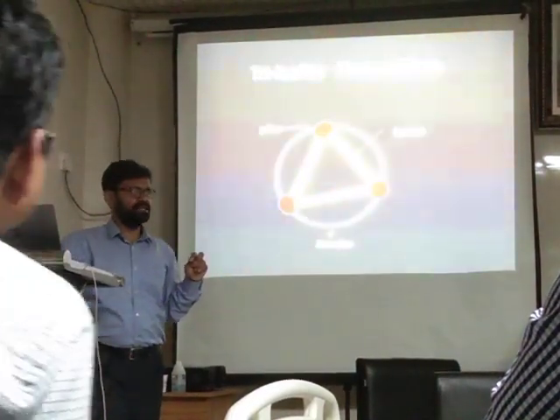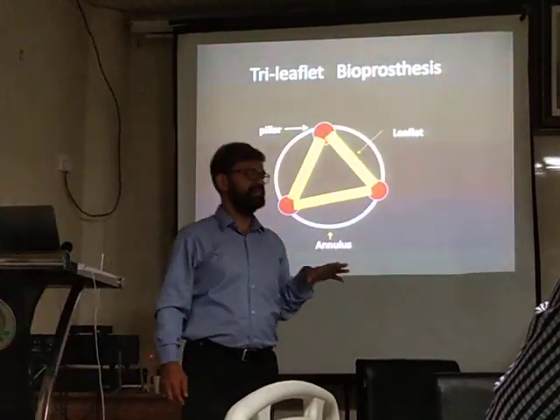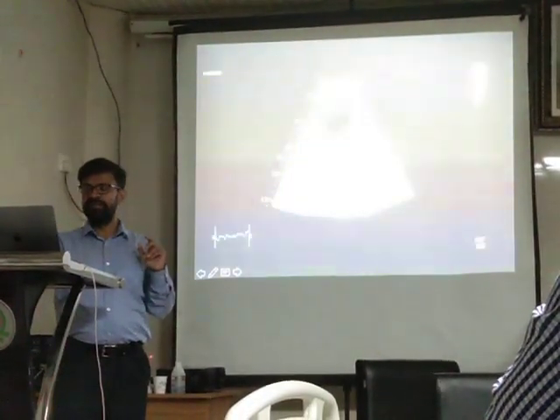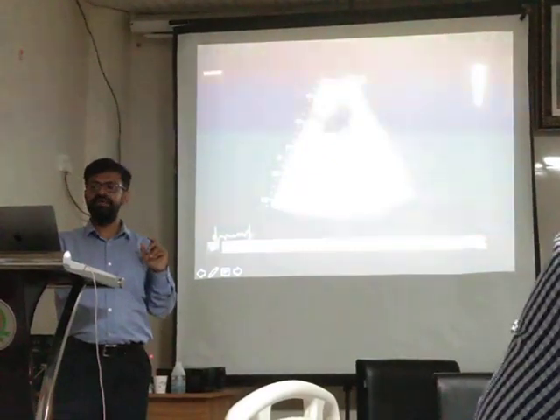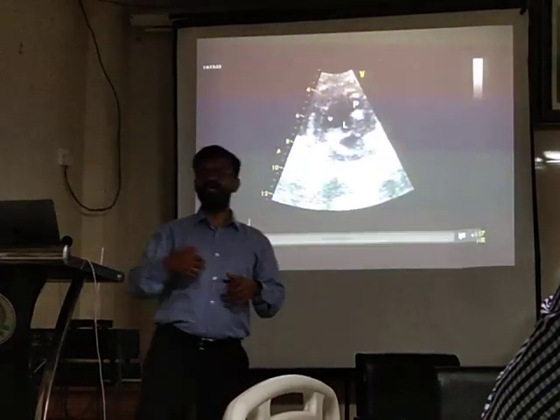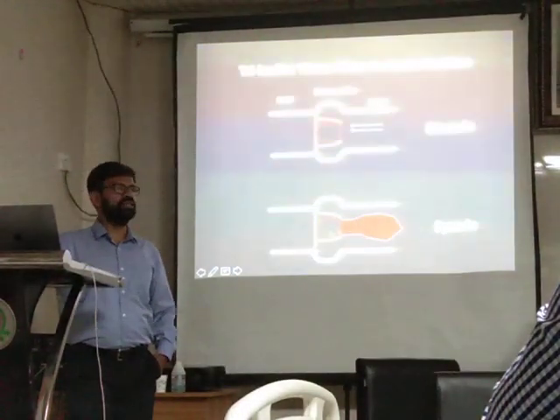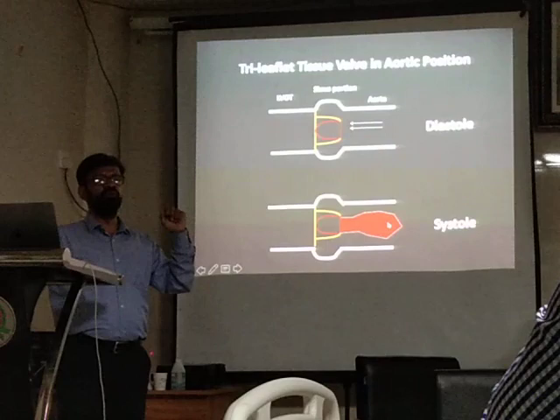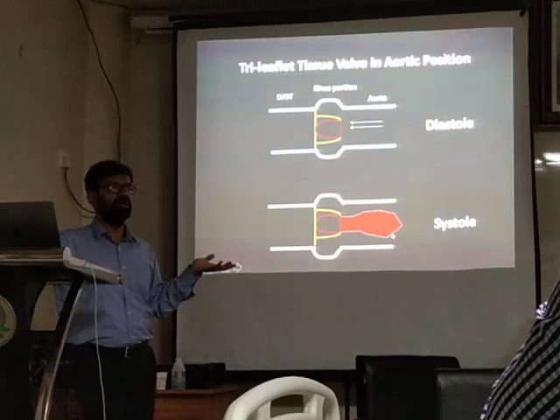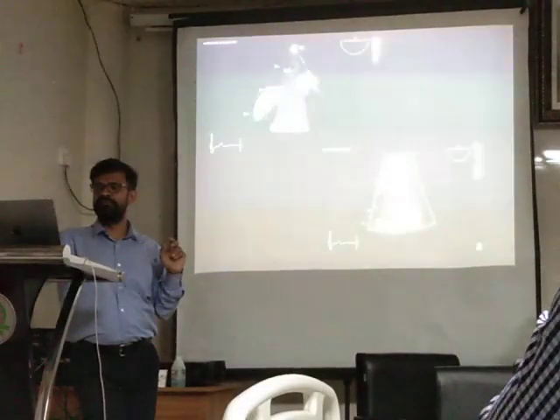Then bioprosthesis, now. The surgeons are getting good bioprostheses. Their life is 10 to 15 years. Actually, young patients are receiving them. So you should see the annulus and the pillars. The bioprosthesis in the parasternal short axis shows 1, 2, 3, with pillars. Generally, they will have a sternotomy and you can identify. The biggest advantage of bioprostheses is the flow is central, single flow. It is more hemodynamic as compared to a metallic valve. That's why it is preferred now. So they give better outcomes.